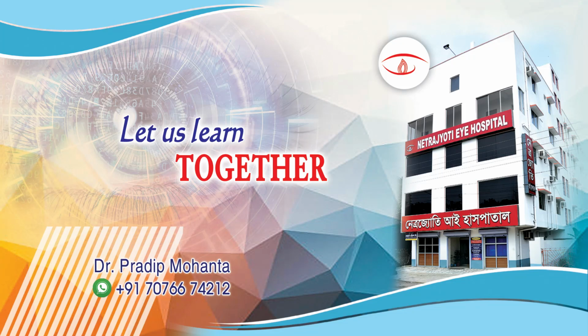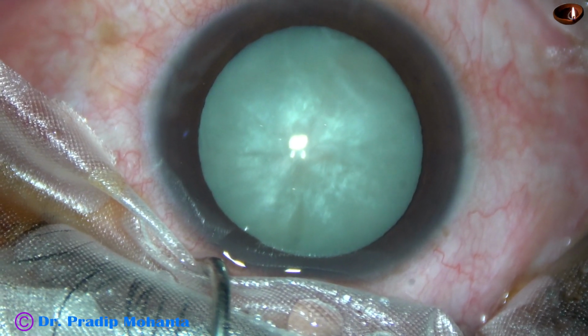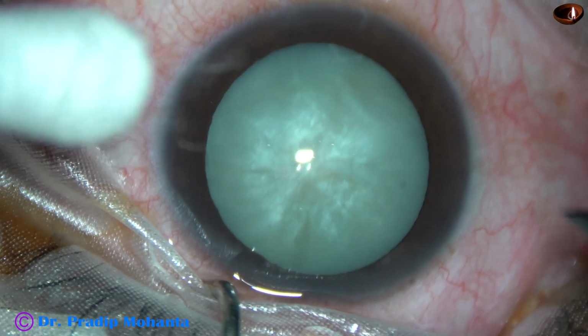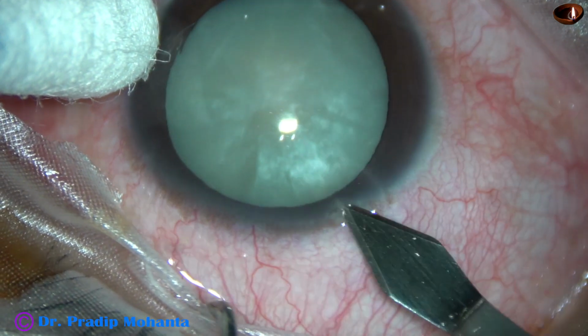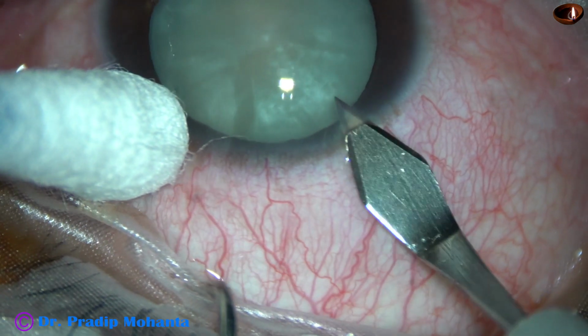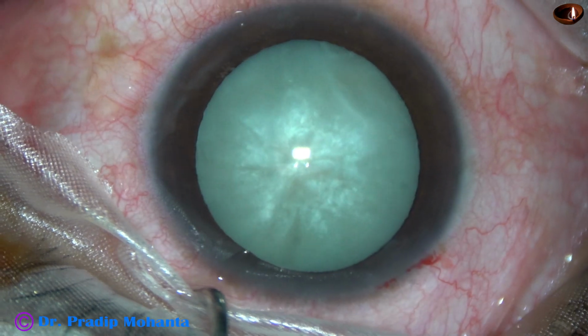Friends, welcome to my workplace at Ranaghat, West Bengal, India. This is an intumescent cataract with high intralenticular pressure. Now let us think why it happens, why the intralenticular pressure increases in cases with intumescent cataracts.